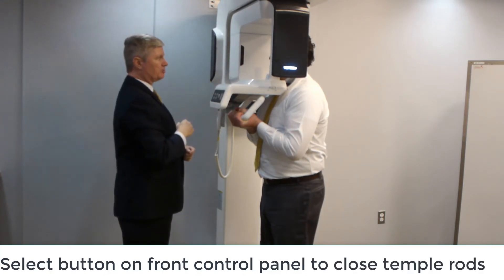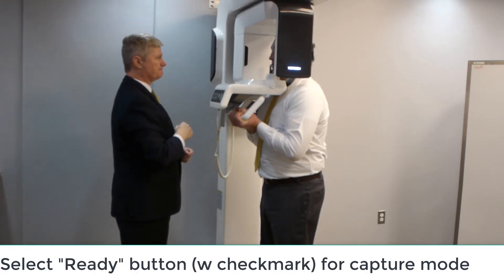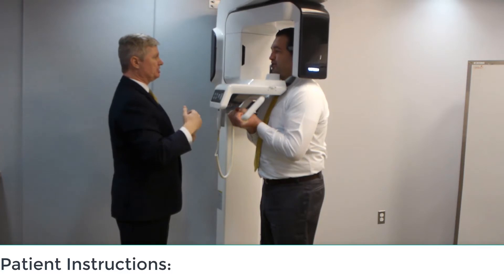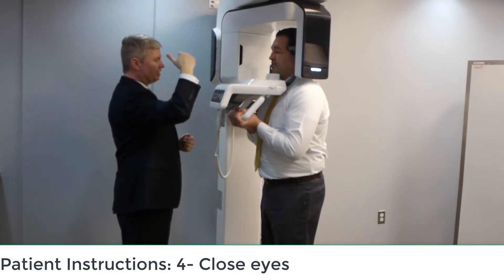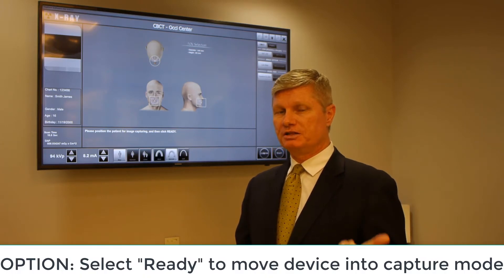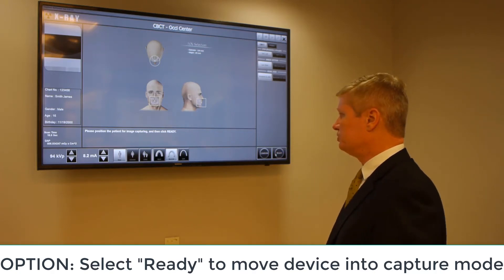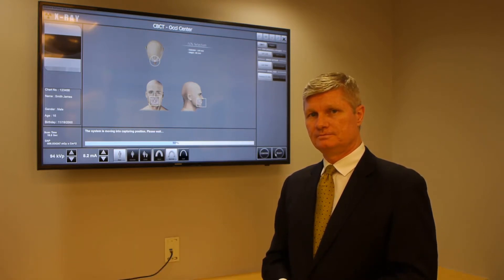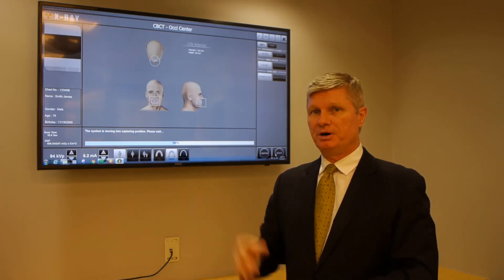From here, go ahead and close the temple rods, then put the device into our capture mode — the system is moving into capturing position, please wait. Have the patient swallow, place their entire tongue against the roof of their mouth, breathe slowly through their nose, close their eyes, and count to 30. You can click the Ready button either on the device itself or on the screen. By clicking Ready, the device moves into capture mode.